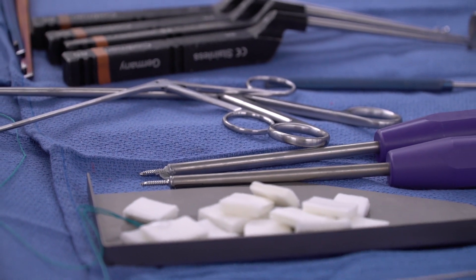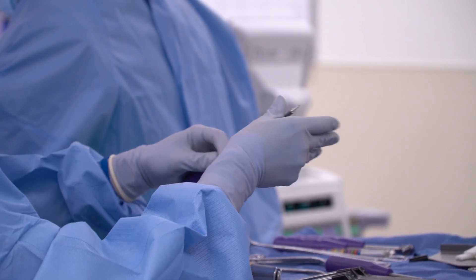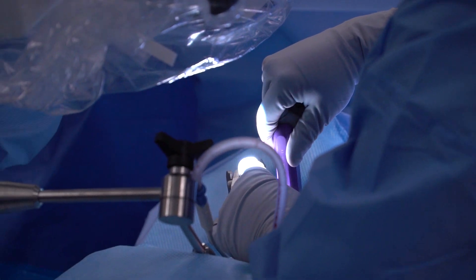The quick-start mechanism is also nice because it has good feedback when you're advancing in the bone. I've done a couple of patients with softer bone, and with limited turns it allows you to have a seated position that stays flush against the bone. With the quick-start screws, the limited number of turns is beneficial because some of the other smaller cast-part pins have smaller threads requiring many more turns. When you're at the top or bottom of the construct, you're always worried about soft tissue creeping and winding, so doing it with limited turns allows you to work safely and more efficiently.